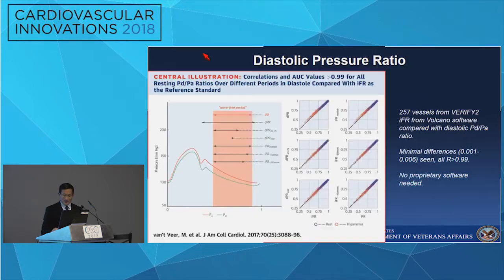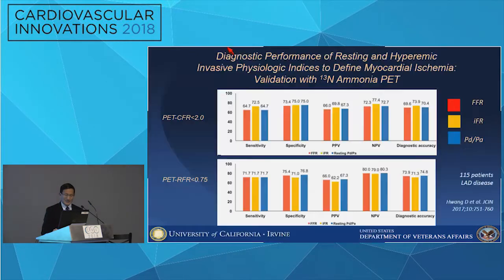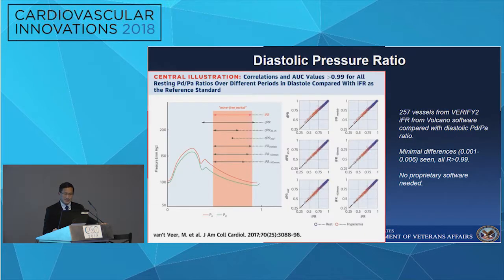And one of the questions is, can we ever get to perfect agreement? Is there any gold standard to ischemia? Many people will say that FFR was the gold standard for ischemia. It's not a slam dunk for me anymore. I mean, the guidelines are starting to say that FFR is still the gold standard. It has the most evidence behind it. But I think that all these measures have some degree of a suggestion of what ischemia is.